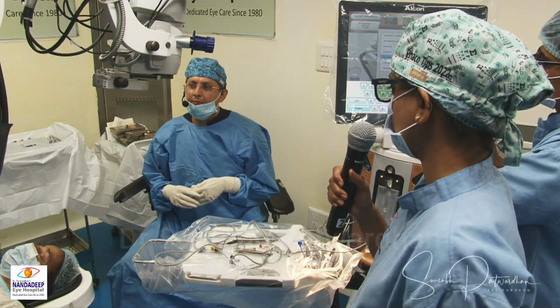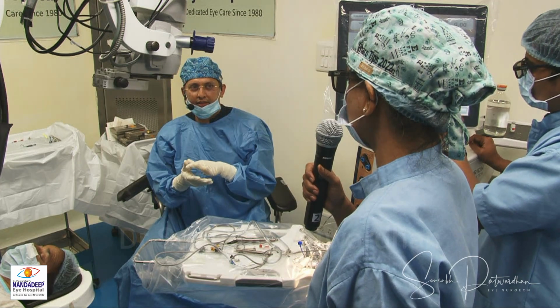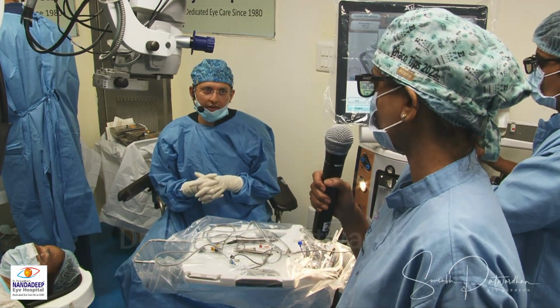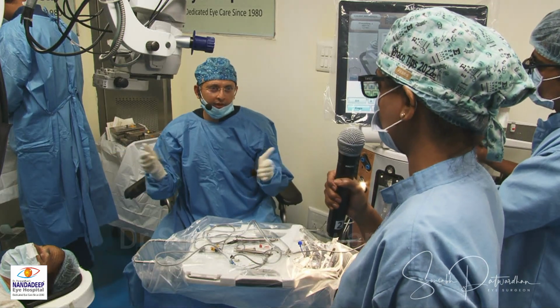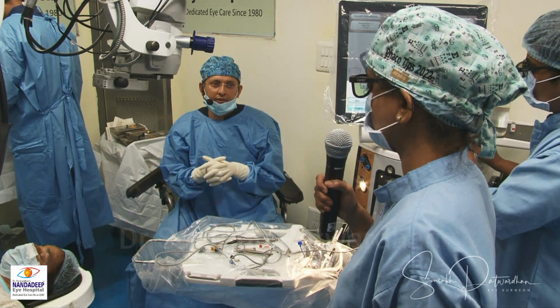But I think it's primarily to do with the IOL material and the design. How tacky and sticky is the IOL material? Yeah, I think that is the most important part about this. Because these IOLs are quite big. I mean, if you see the haptic to haptic, it's almost 12.5, and the bag is just 9 millimeter. So it's already stretching, trying to stay in place.